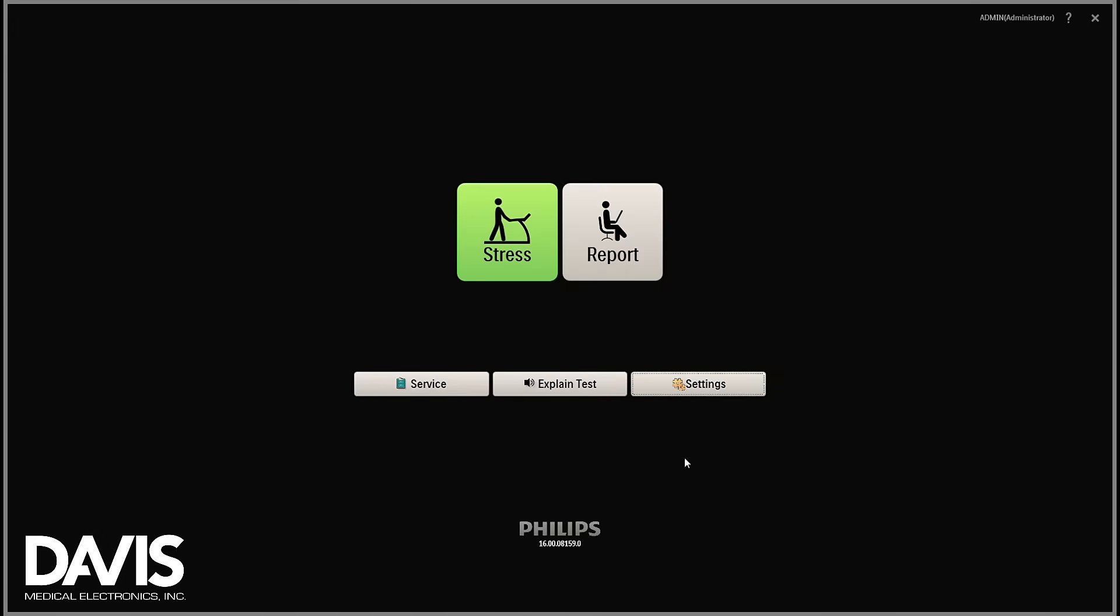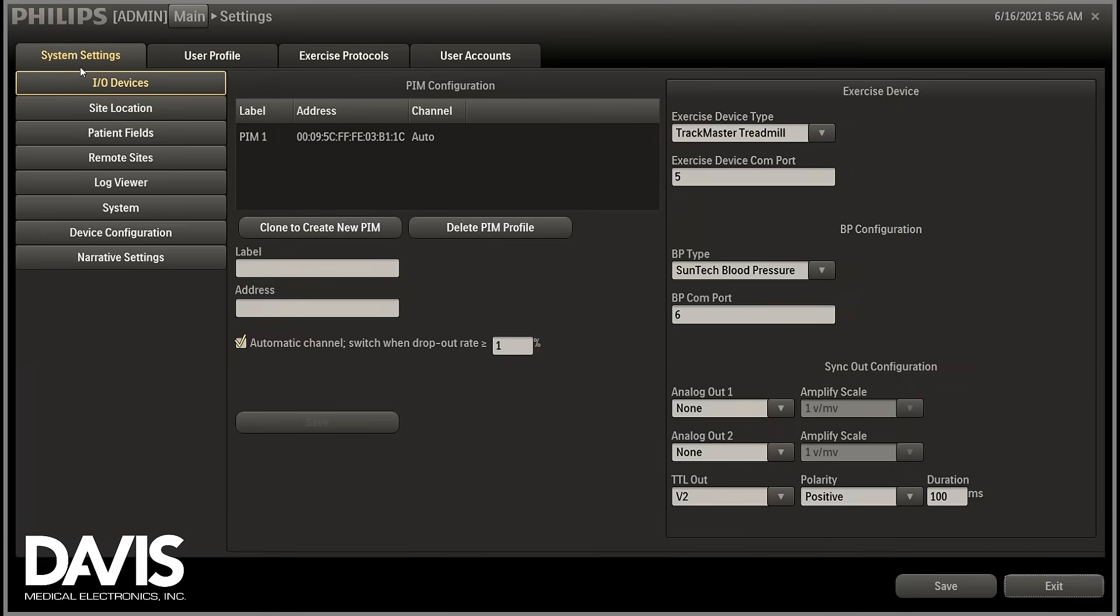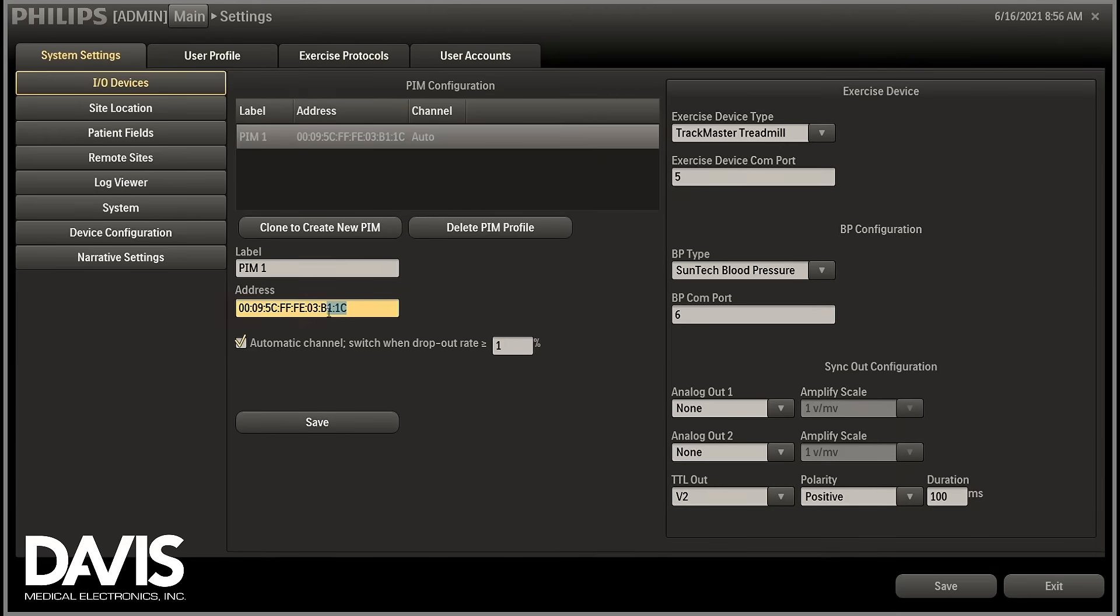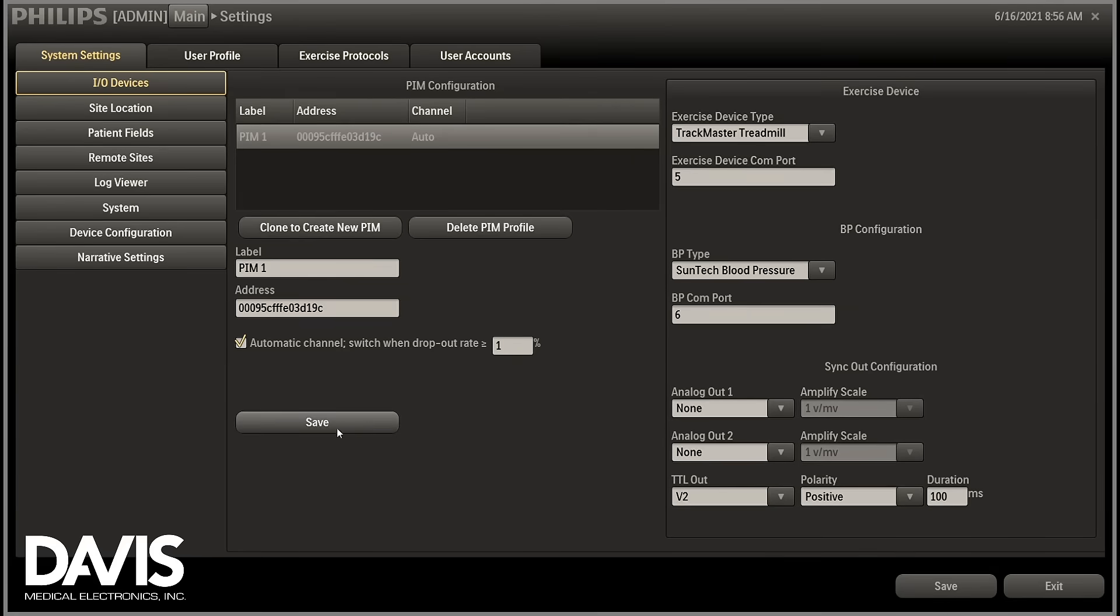If you are configuring a brand new PIM module for the first time, select the settings option, otherwise skip this step. On the system settings tab, select I/O devices, highlight the default PIM MAC address, paste your current PIM MAC address, and save. Also save when exiting this window.